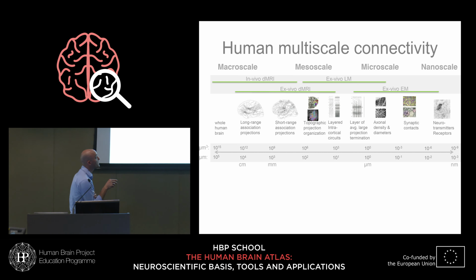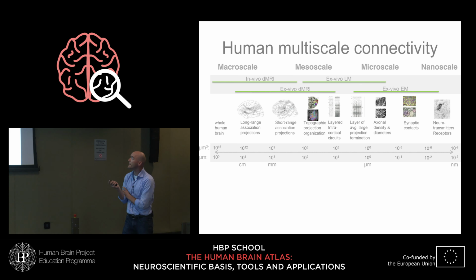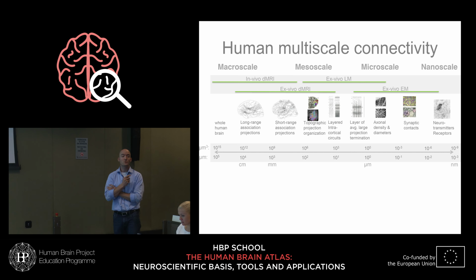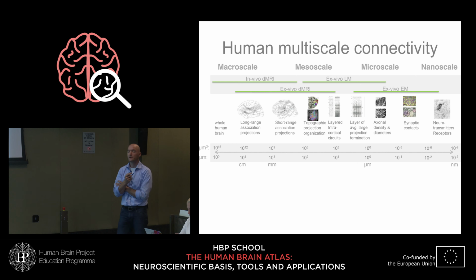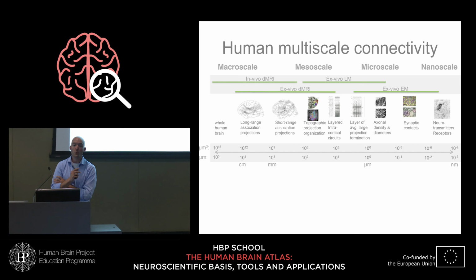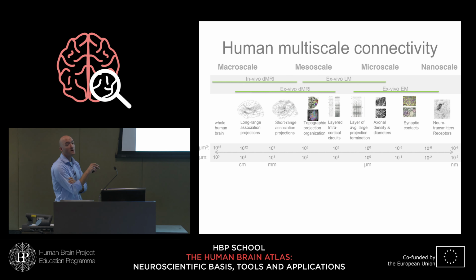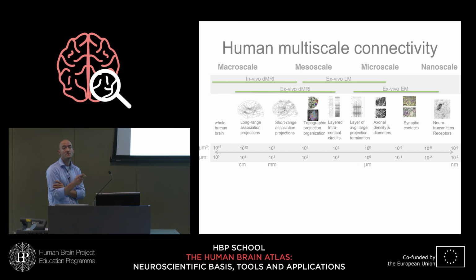Alright, and as soon, of course, as we go down even further and we travel down to single axons in synaptic contexts, we seem to be entering the realm of ex vivo electron microscopy. So if you really wanted to see a synaptic contact, right, a dendritic spine contact to an axonal bouton, probably we would have to go to an electron microscope, although I have to note that there are very interesting developments very recently in so-called super resolution light microscopy, where the diffraction limit, the limit of about 300 to 400 nanometers, 0.3, 0.4 micrometers, can now be broken on a regular basis with light microscopes, and they can image down to 100 nanometers. Getting closer, but not quite equal to EM resolution.